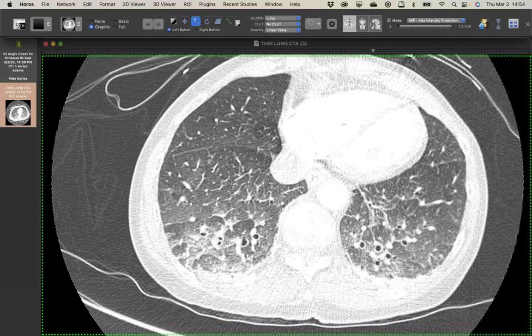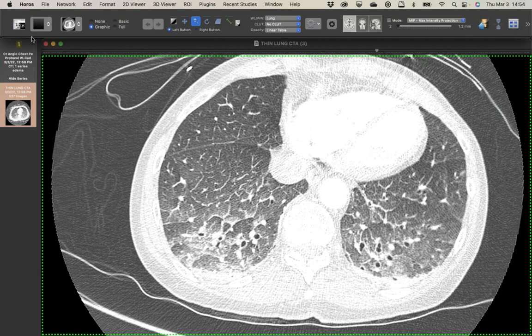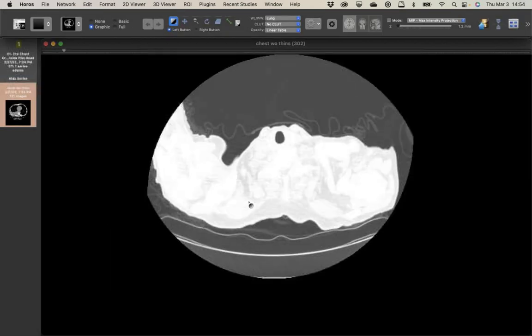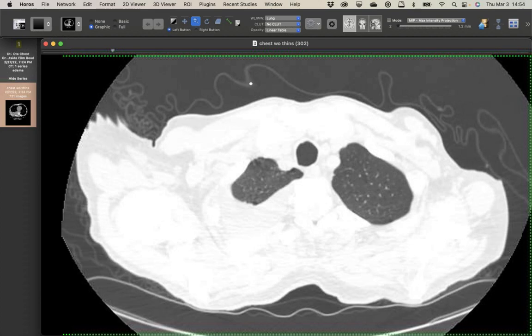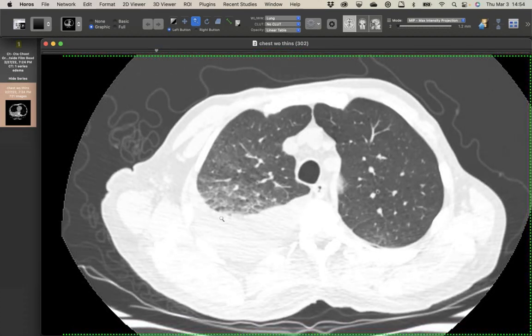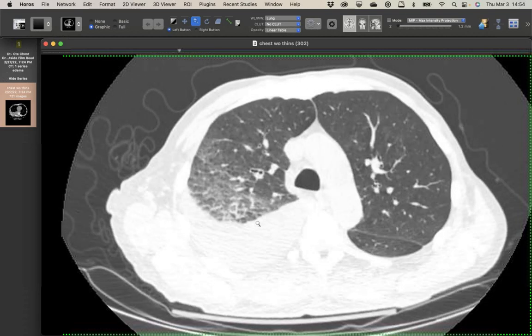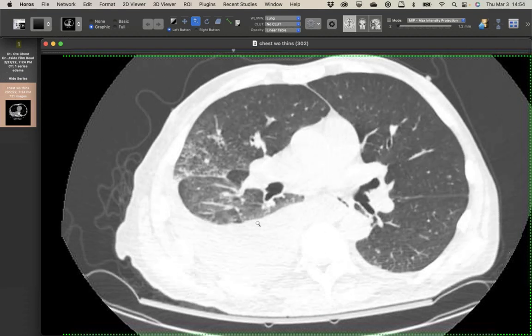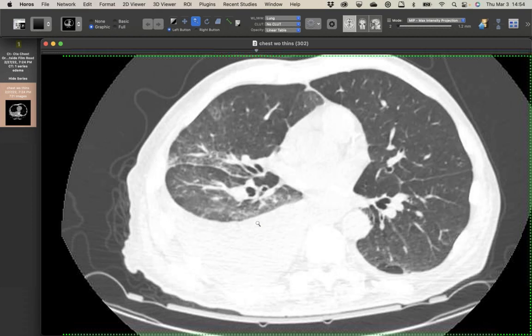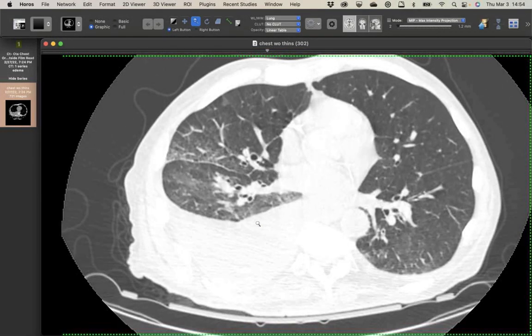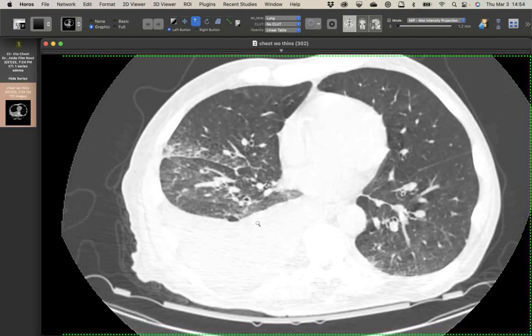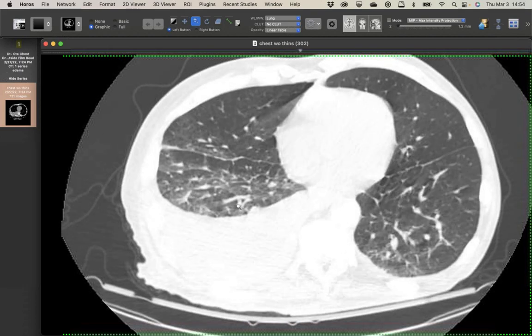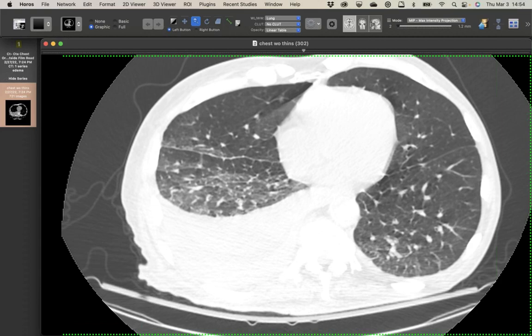Here's the article Howard showed us, with a prettier example — named from the Chinese landscape paintings of these karst mountains. I had another case this week as well — a different patient, not post-op, another edema but not re-expansion edema. You can see there's an effusion, but look at these — also quite nice examples of the lobular gradient sign. Ever since you guys showed this sign, I've probably walked by it before, but I was pretty confident this was edema with that gradient.